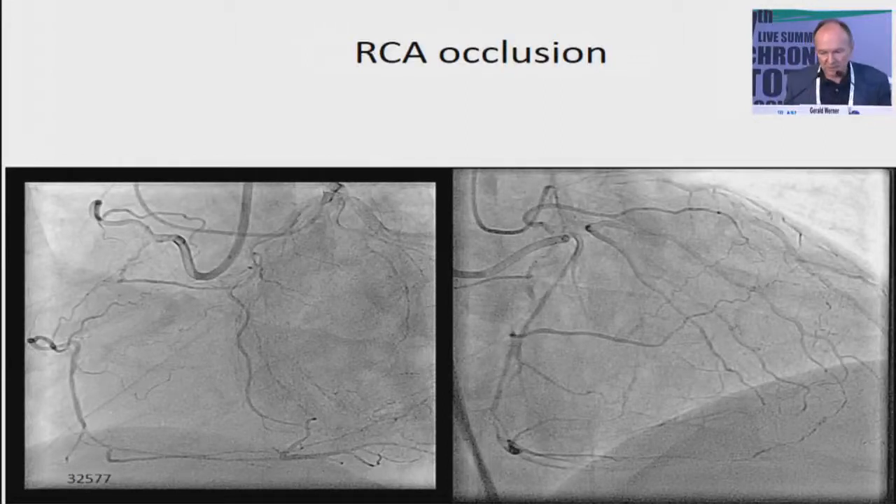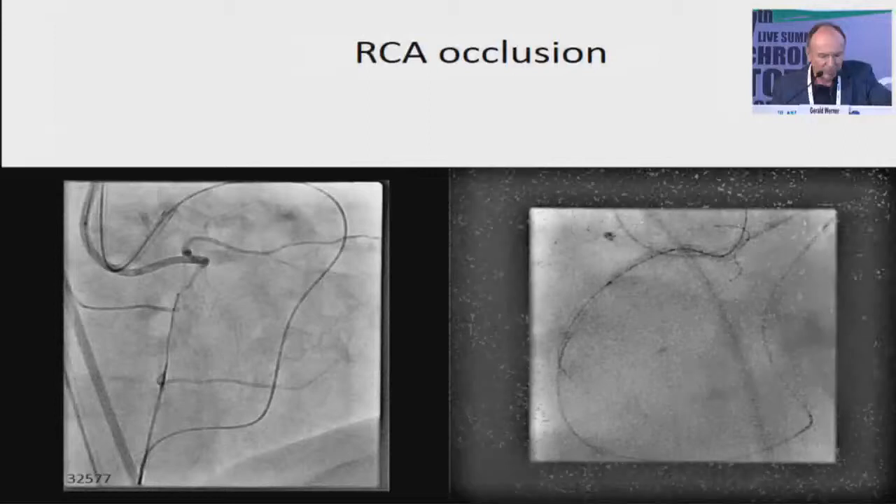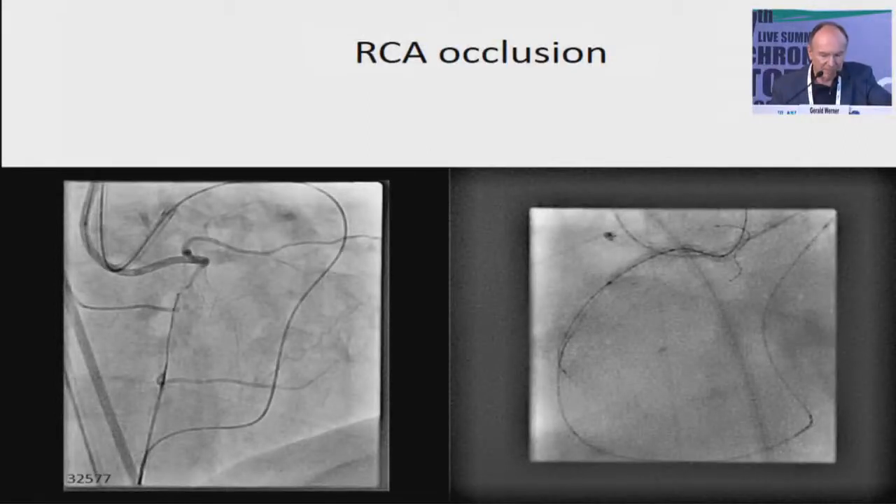I want to show you three examples to highlight my points. This is a long CTO, ambiguous. We do a retrograde approach — retrograde is easy. The wire is almost there. We come with an antegrade wire, we are overlapping. I do the usual balloon inflation, but the retrograde wire will simply not advance. So I need to understand what to do.